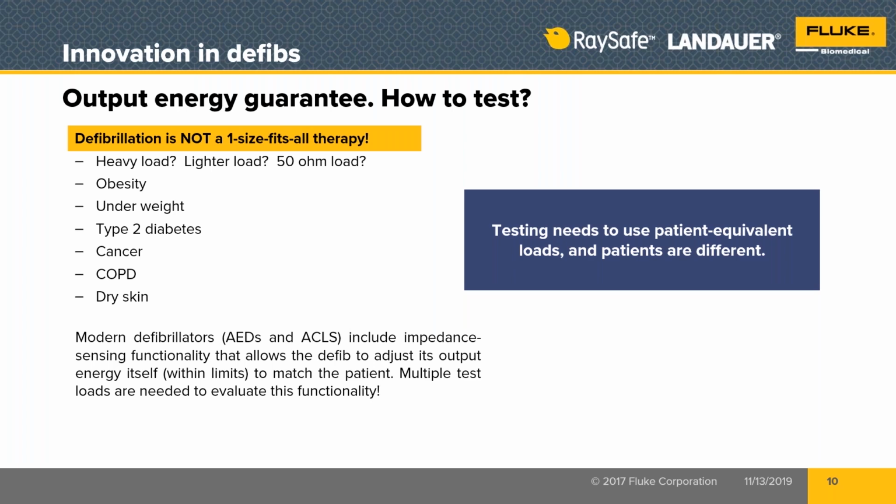Okay. All right. So as we look at these automatic external defibrillators, and the newest, say in the last 5 years or so, maybe a little longer, full advanced cardiac life support defibrillators, we see the ability for them to have a little bit of an output energy guarantee. Now, what do I mean by that?